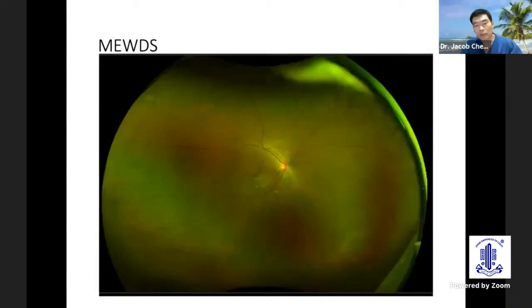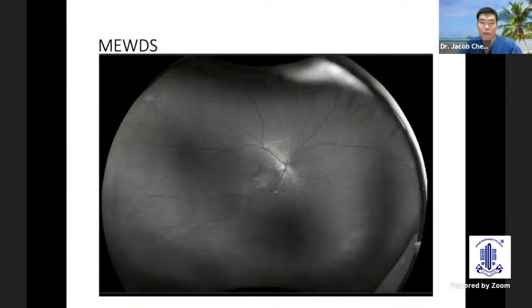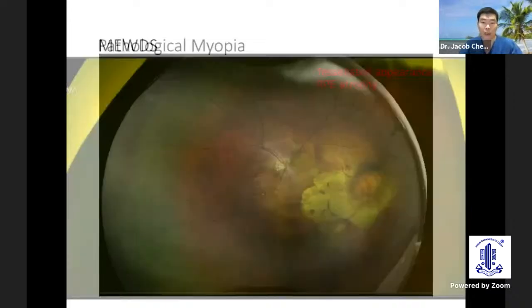Follow-up color fundus photograph shows disappearing and resolution of the white dots. The choroidal red channel is normal, and again with the green channel, you see resolution of those white dots.